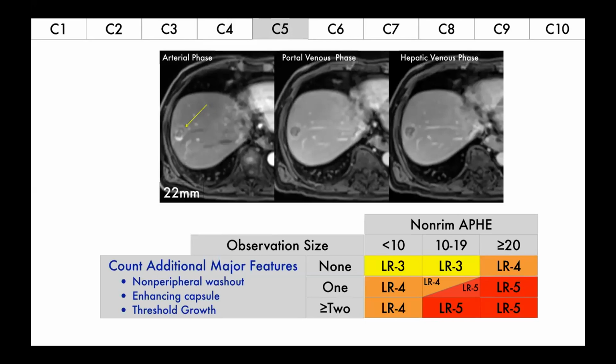Pretty much a similar pattern of enhancement. One more, which you're seeing in segment 6. Oh, sorry, this will be segment 8. And again, note the pattern of enhancement which you see. You see these squiggly areas, small areas of neovascularity, which you tend to see not only within the core of the lesion, you might even see these arc-like patterns of enhancement. Now, please remember, capsular enhancement, though it could be discontinuous, is best appreciated on the venous phases, typically the hepatic venous phase, and you can see the homogeneity of the capsule. Of course, the capsule could be discontinuous and broken down, but ideally it is best appreciated on the venous phase.